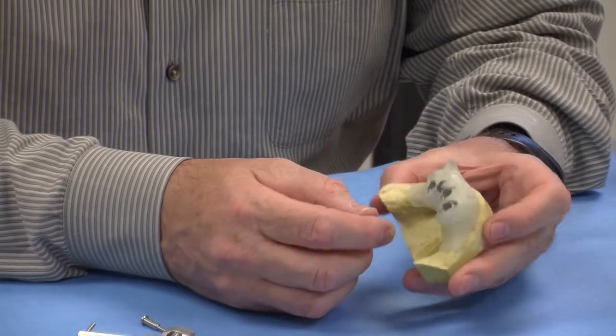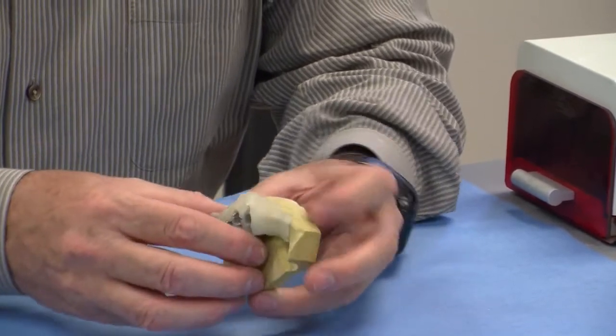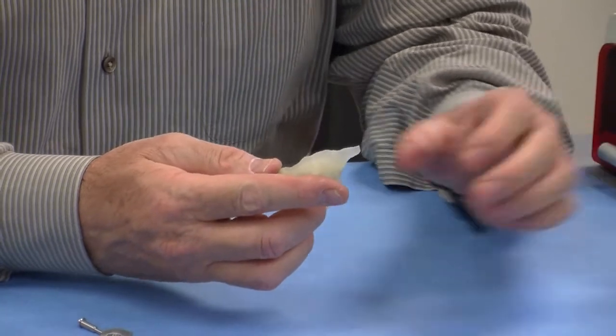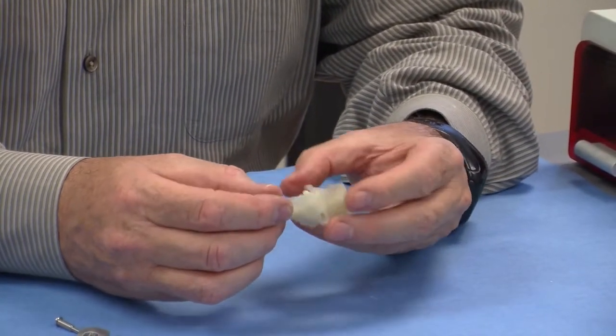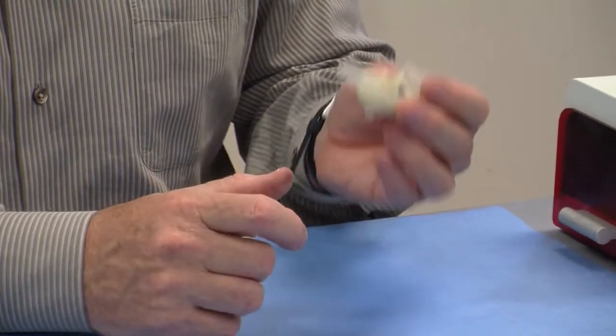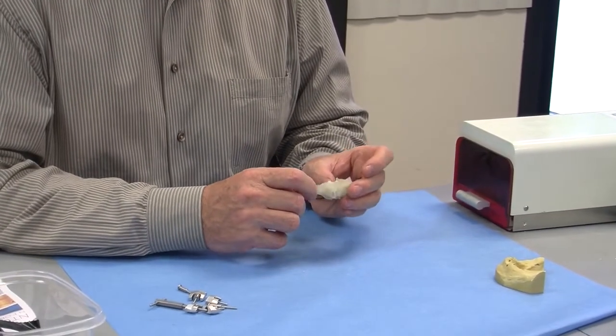After 6 minutes, we remove all the pin holders, and then the guide is separated, and we are going to cure it in the open position or below to assure that everything is cured.